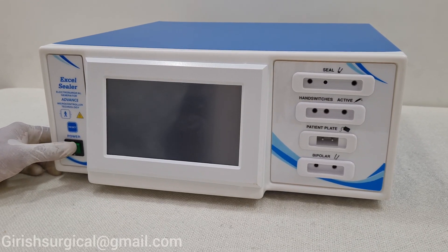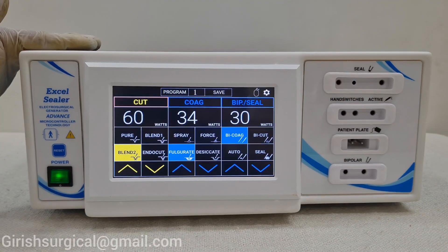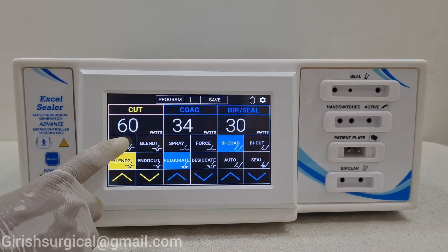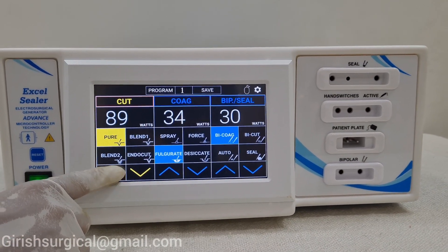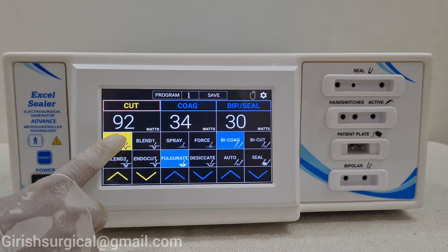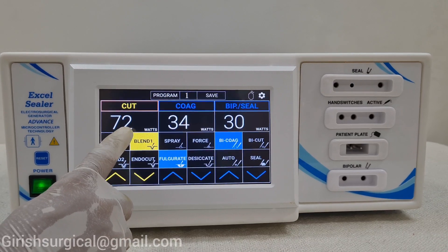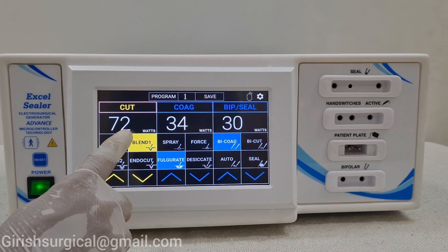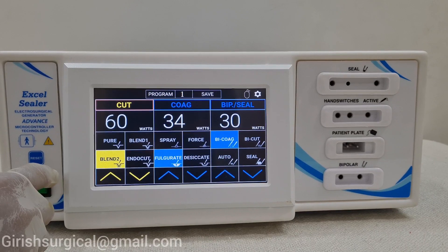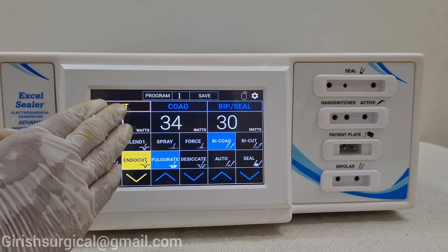Now we will put on the machine. This is the screen that comes up. In this Axel Sealer the touch screen machine is there. Now we will go on to the first feature, that is pure cut. In this pure cut, you can increase or decrease the output with this touch button — it will be 100% cutting. Now we will see blend one: in this blend, the cutting will be 70% and 30% will be coagulation. In blend two, it will be 60% cutting and 40% coagulation. Endocut is used for underwater. This is the cutting features column.